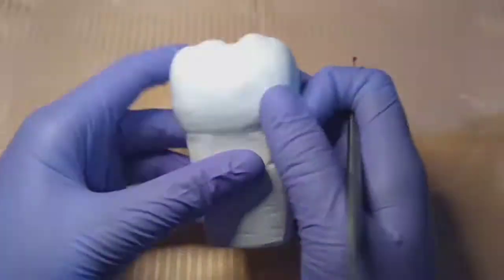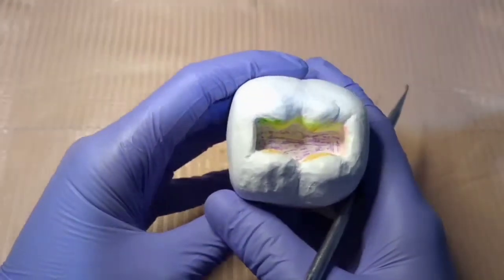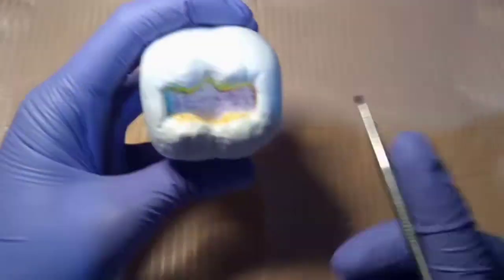This is the final product of my carving in Class 1 cavity preparation. So I will explain to you the 5 walls, 8 line angles, and 4 point angles. First, let's tackle the walls.